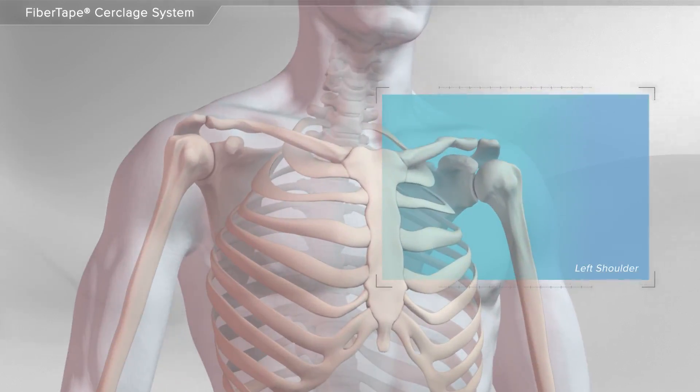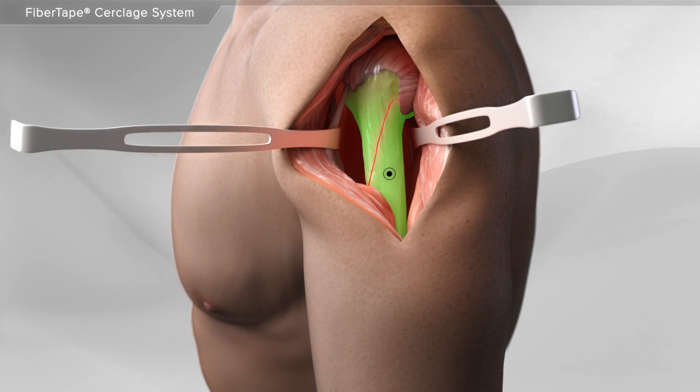In this animation, we will show the repair of a fracture using the circlage technique. In this example, a fracture of the humerus or arm bone can be repaired using the circlage technique alone or with other types of implants to help stabilize the bones.